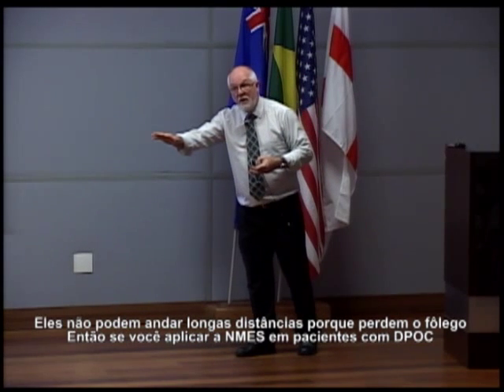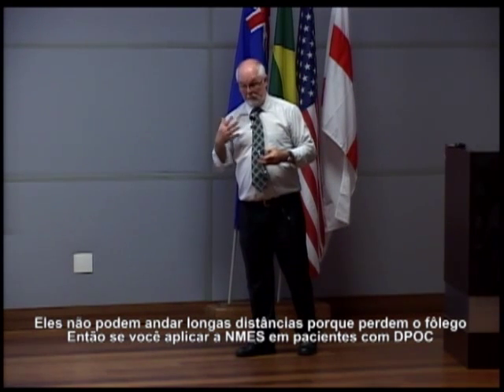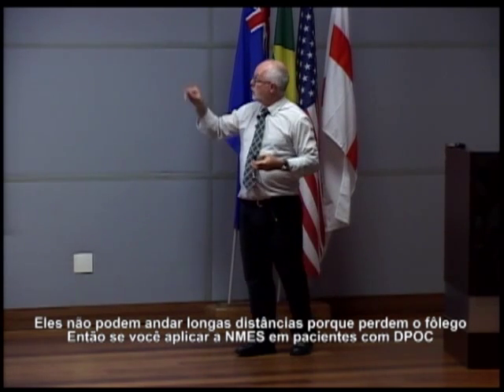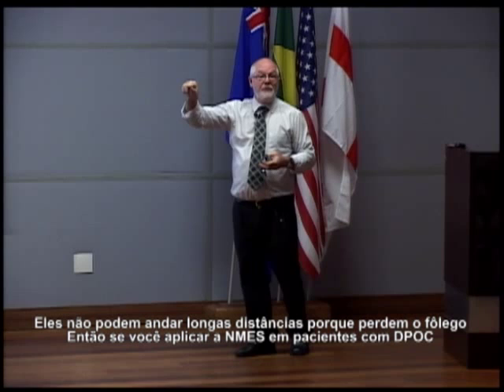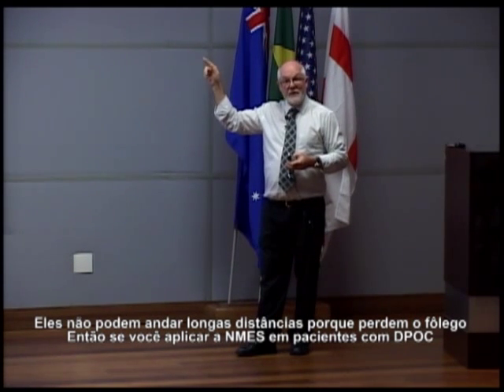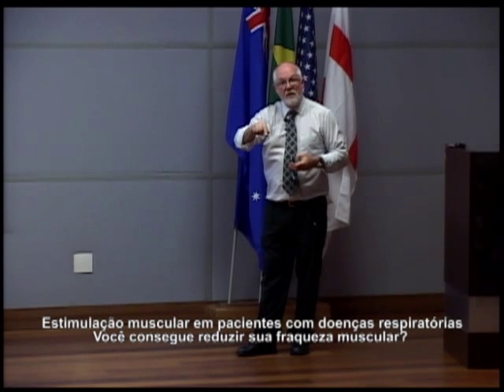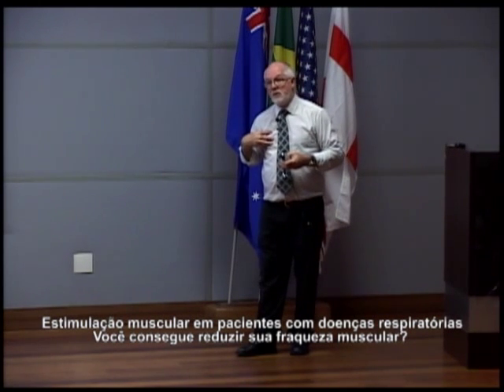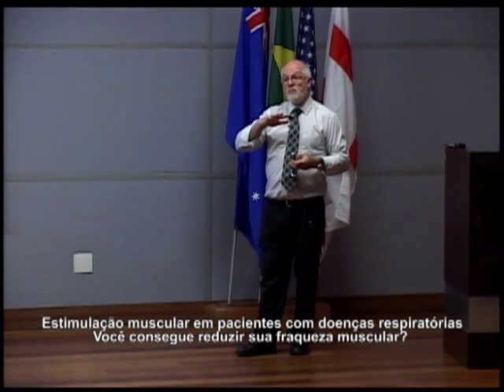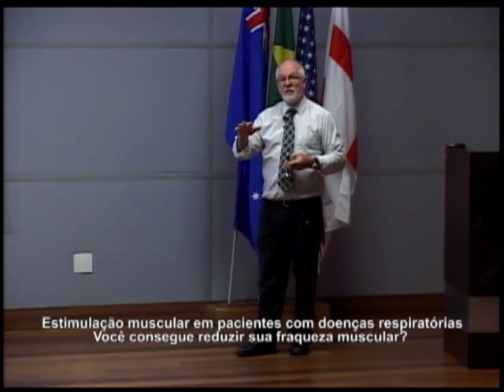They can't walk for a long distance because they lose their breath. They become breathless. So if you do NMES to patients with COPD, so you do muscle stim to patients with severe respiratory disease, can you help to reduce their muscle weakness?